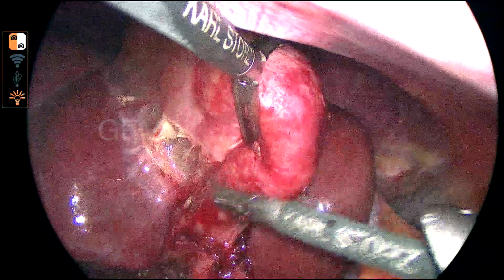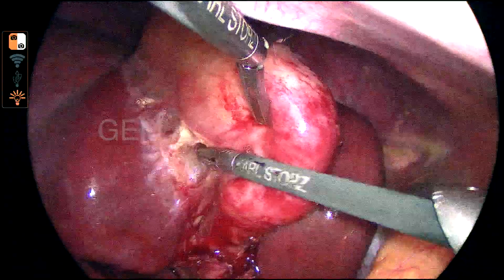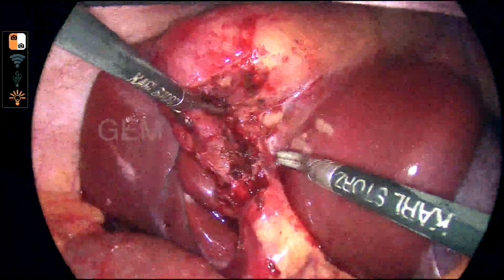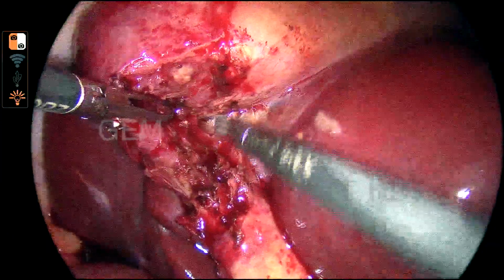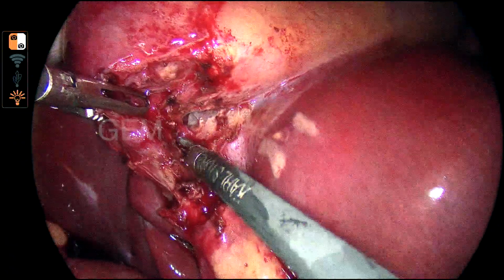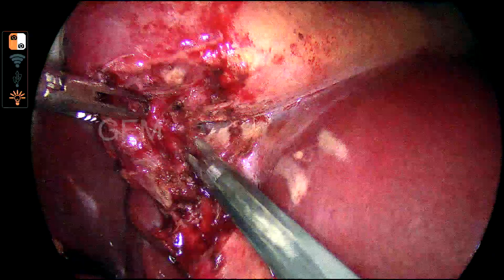Since the artery is divided, there is less traction, so that I could mobilize the gallbladder medially, and then I am able to see the posterior. Now you can see this, that is the critical view of safety you can see now. And these are all the branches of the cystic artery.